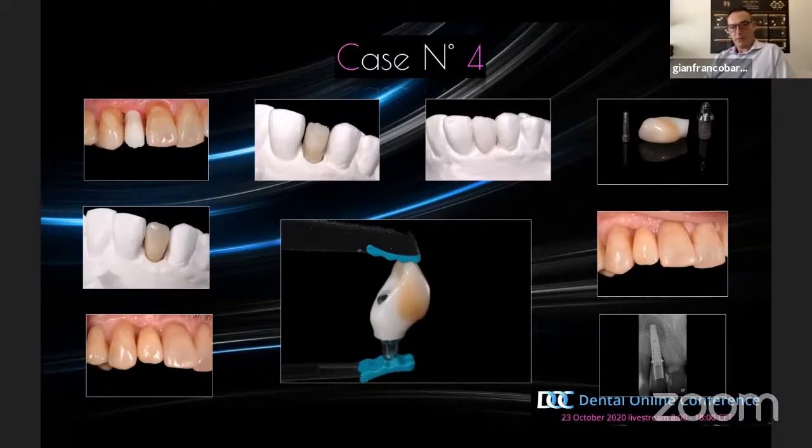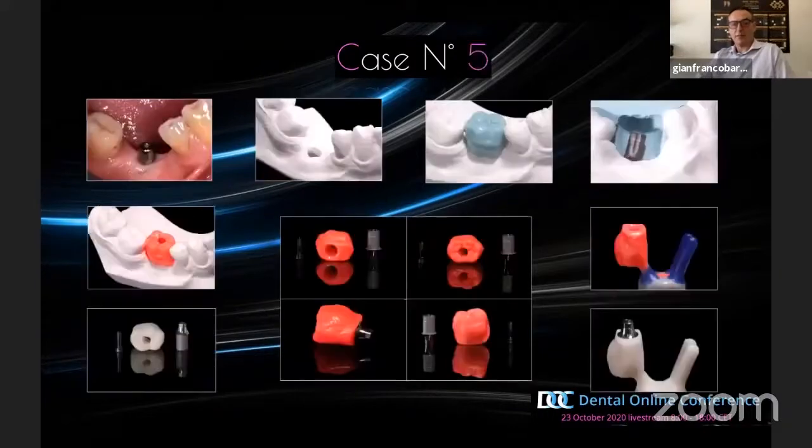We can see in the X-ray the fitness of this crown, and it was easy to do, with respect for all the characteristic features of this abutment.